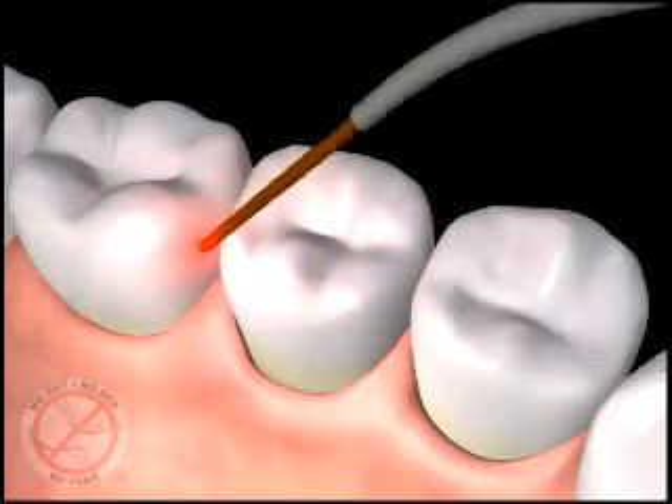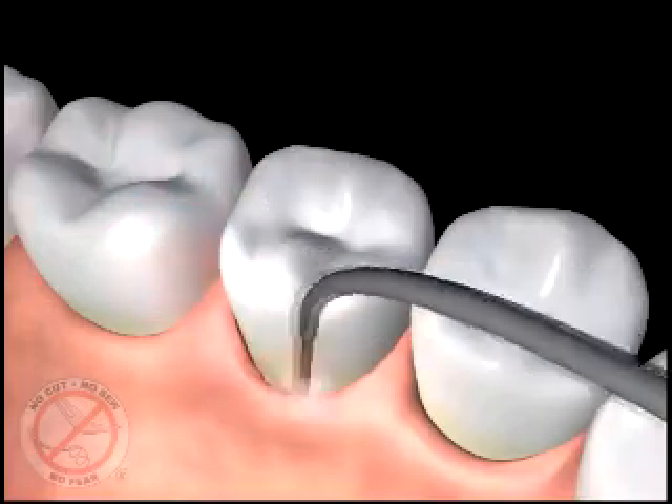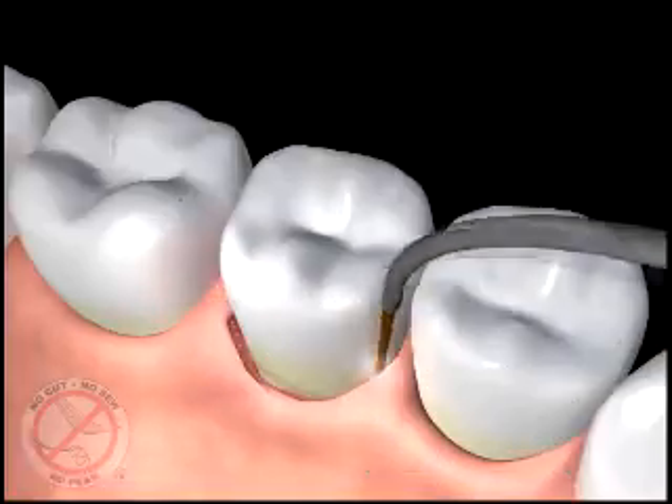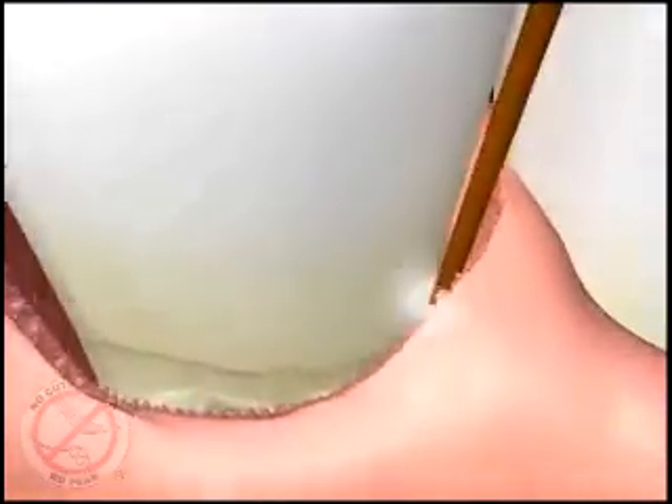The fiber optic tip is gently placed at the top of the periodontal pocket to begin removal of diseased tissue that lines the pocket. This is where bacteria live and build a neighborhood of its own that destroys healthy gum tissue and bone that holds your teeth in their proper position.